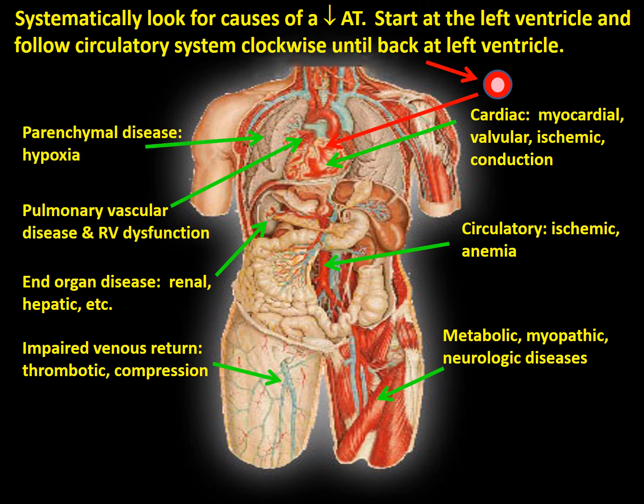And of course, there are all of the pulmonary parenchymal lung diseases that cause hypoxemia, whether obstructive, ILD, or chest wall mechanical or neurologic restriction. Keep in mind that when these are present, the AT is not reduced due to hypoxemia unless the patient is actually hypoxic at the anaerobic threshold. If AT is reduced and hypoxemia is not present at that point, it may be secondary to complications of pulmonary disease, such as pulmonary hypertension or cardiac pump failure.